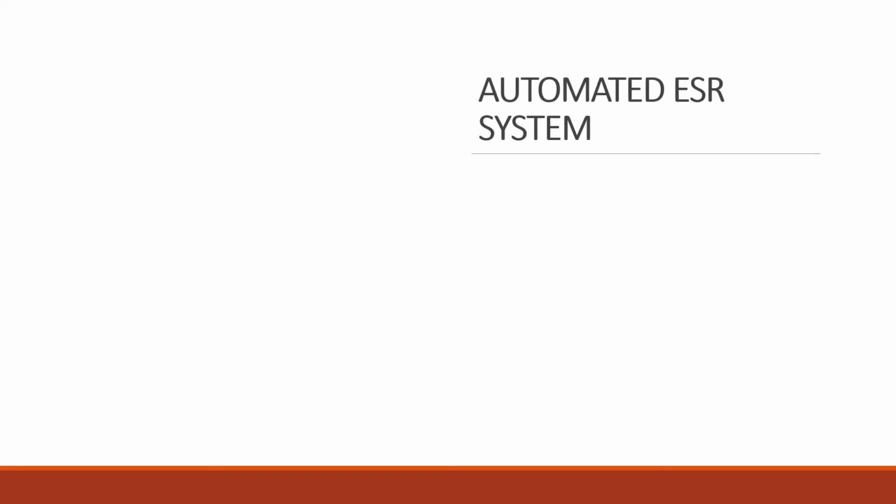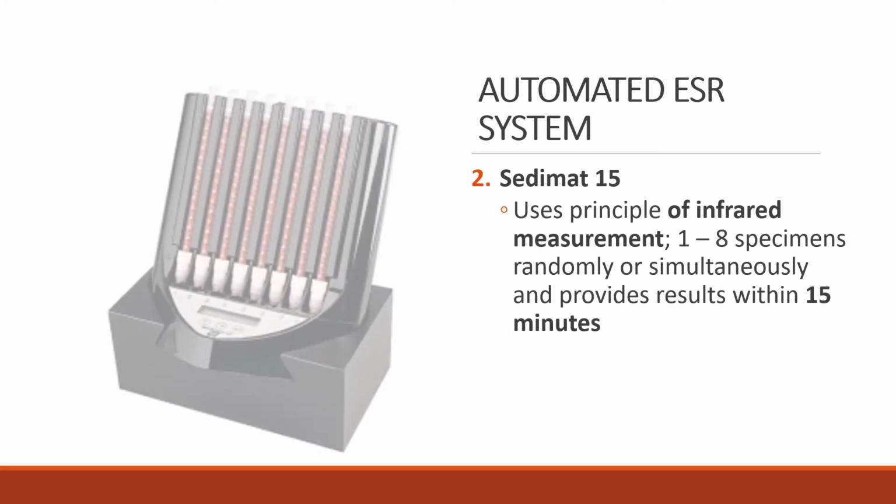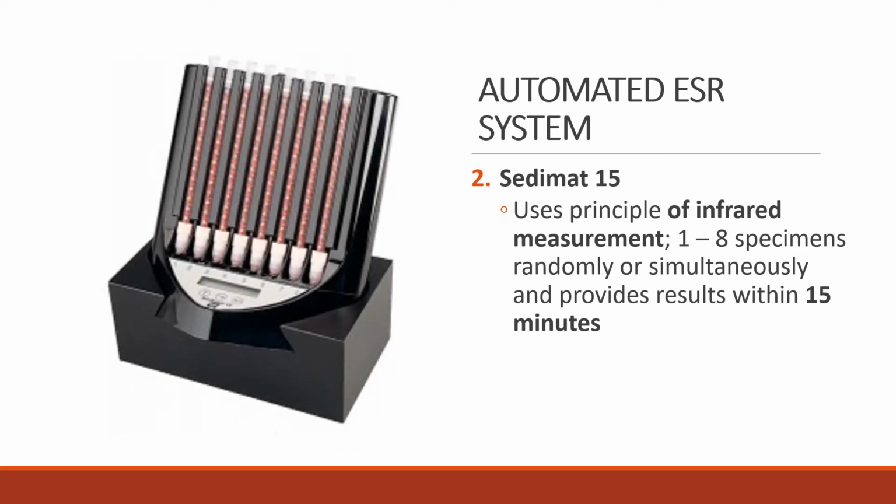Another automated method for ESR is the Sedimat 15, which makes use of the infrared measurement as its principle. You can utilize this machine by placing 1 to 8 specimens randomly or simultaneously, and it provides results within 15 minutes.